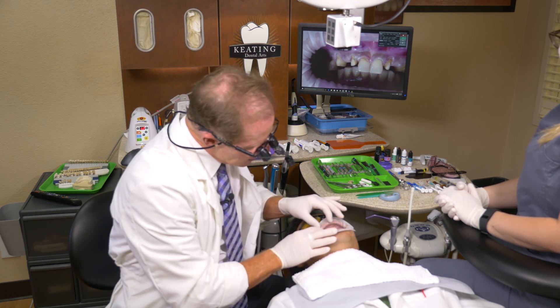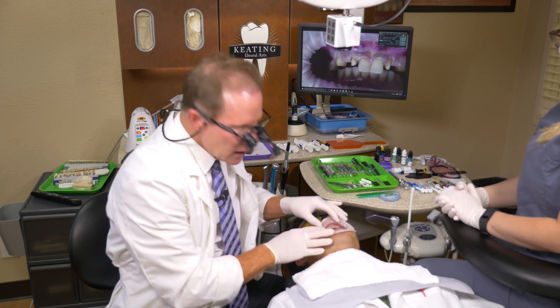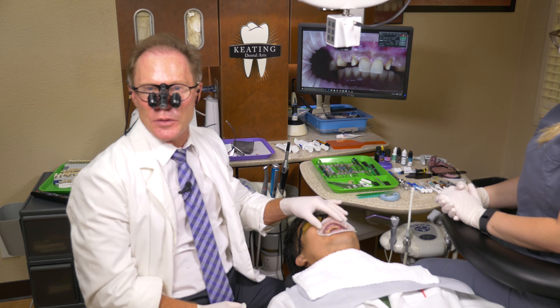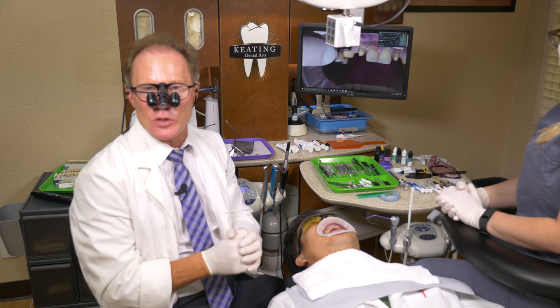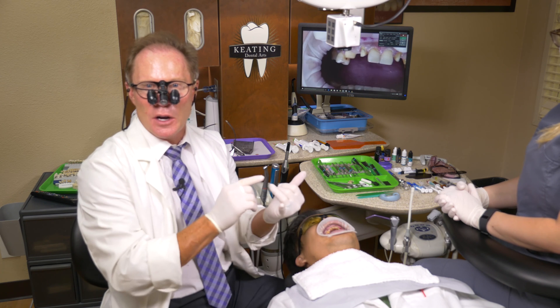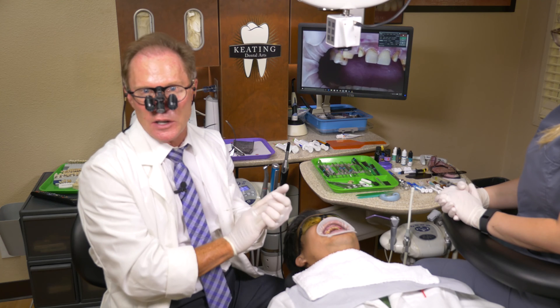Here's Kenny and he's actually missing the maxillary right canine. In the past he had a bridge — you can see from this photo — that utilized a ridge-lap pontic. Traditionally, at least what I learned in dental school, we had two options. We either had a ridge-lap that looked like you took a tooth and super glued it to the front of the ridge — it didn't look natural.